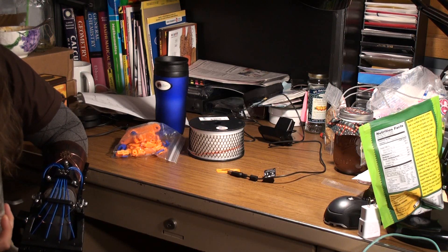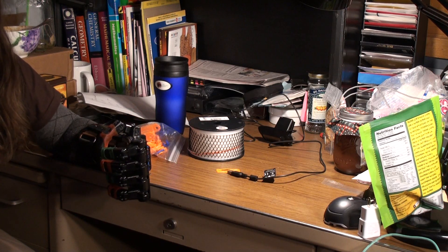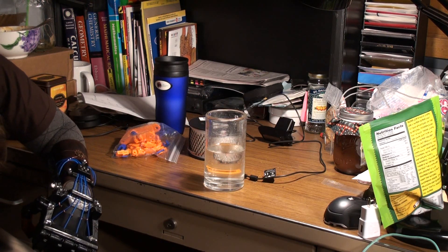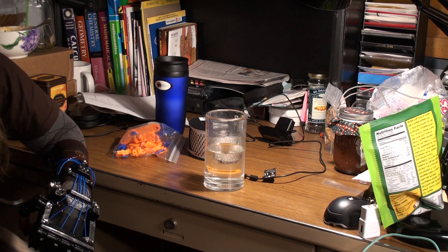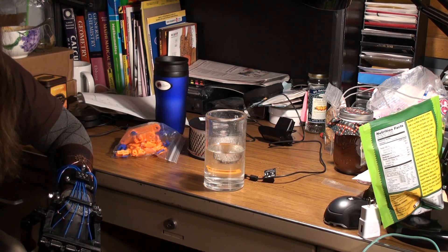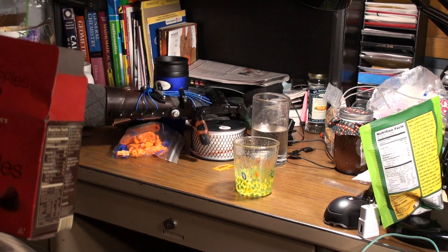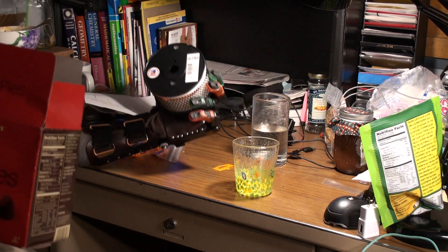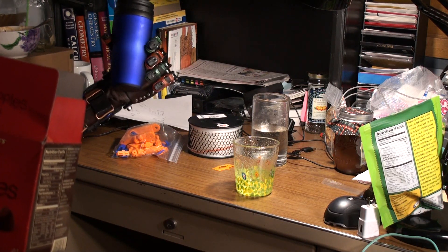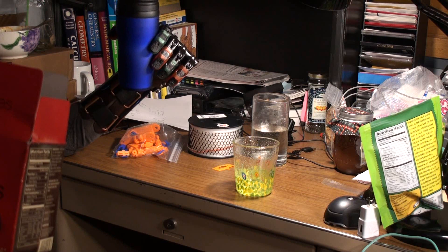This glass is not one that I would want to use for this hand. I've got some cups that work very well with it. I actually have one I really like — it's from REI, it's one of those collapsible cups that squishes down into a little disc, and it's silicone. I'm grabbing from above and you could drink out of that — I wouldn't want to because it's full of water and essential oil right now.